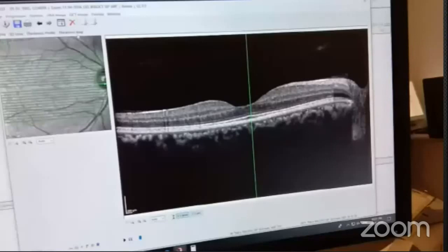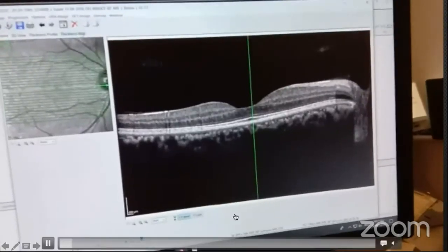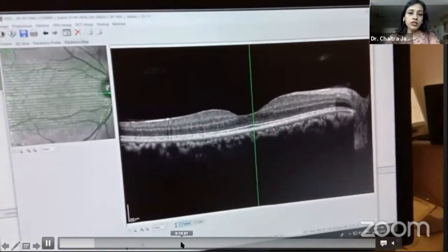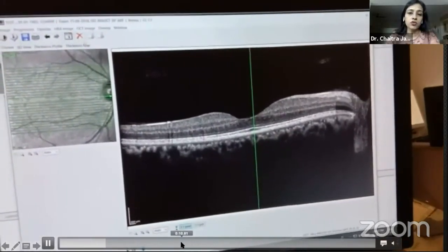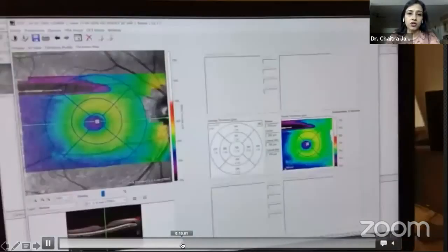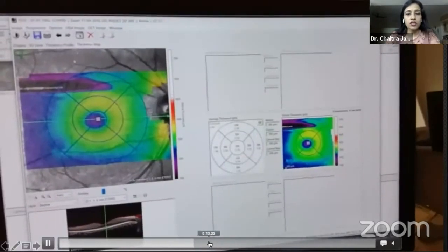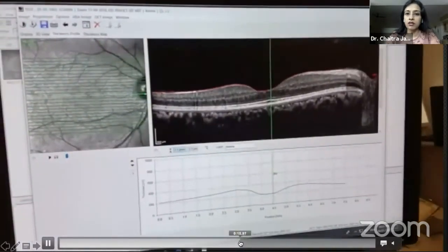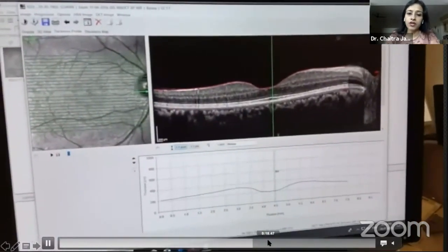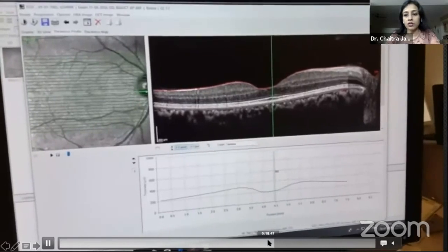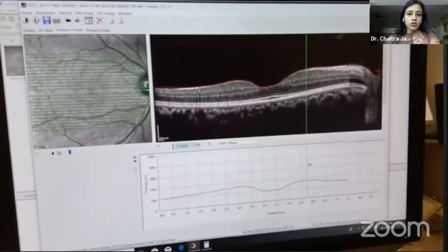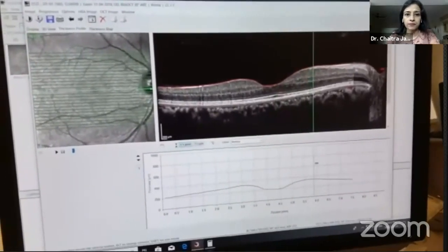This video shows how the thickness mapping works. Not only in the center — you can also move the scan across to see what the thickness is across the fovea and parafoveal areas. It is also possible to do this by dragging the scan.